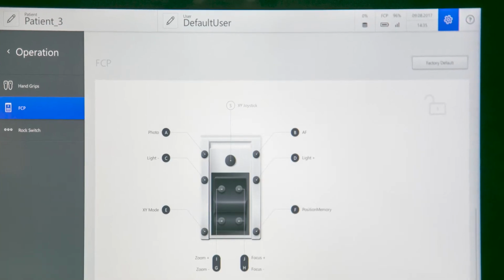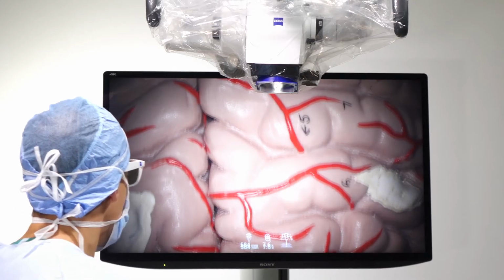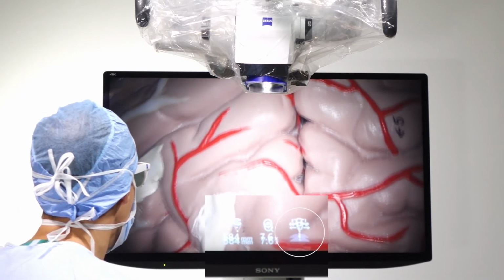For demonstrating this use case, we configured the foot control panel as shown. The screen is configured to display working distance, zoom, and current XY mode.